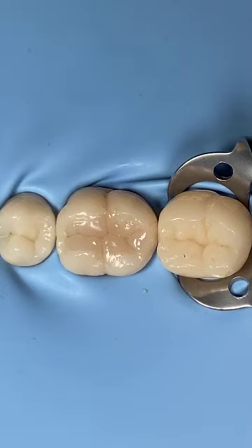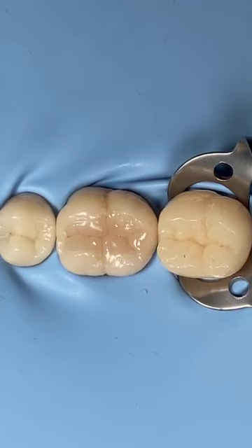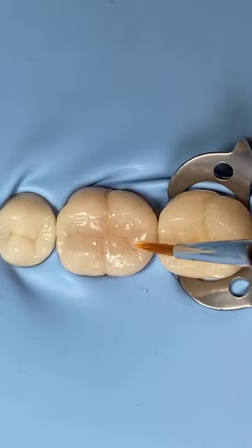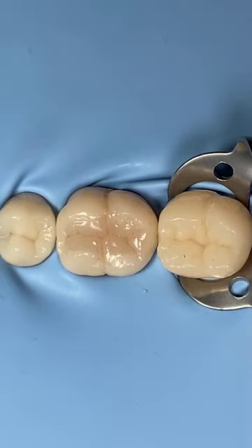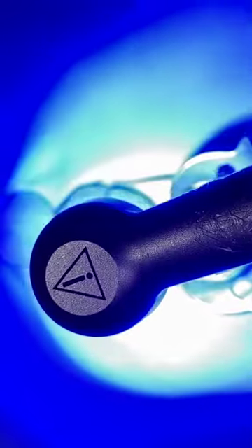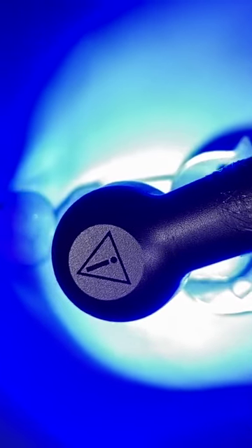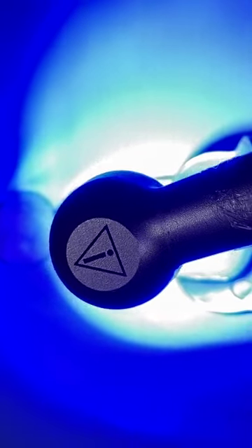Okay, so this is my magic. Wait, I have to make sure where's the brush? Okay. I think it's a bit of excess here. Ah, it's okay. Okay, cure. This is a satisfying sound from the light cure. Try to move it closer.